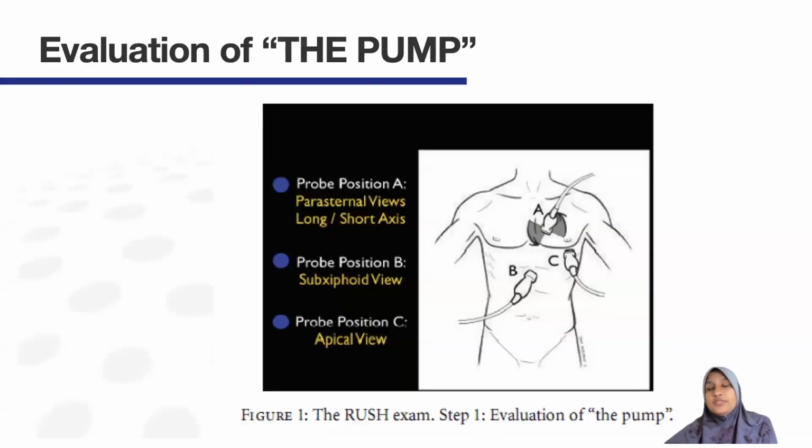So for the purpose of this presentation, I'll only be looking at the RUSH protocol, the pump, tank, and pipes. So let's go through the RUSH protocol. The evaluation of the pump, which is the evaluation of the heart, uses 3 views.